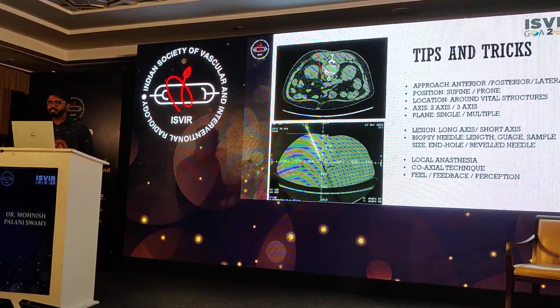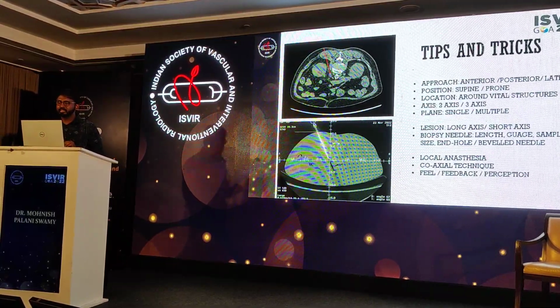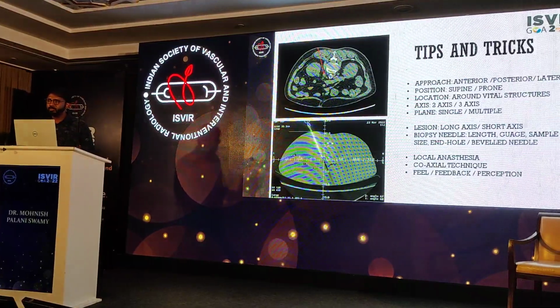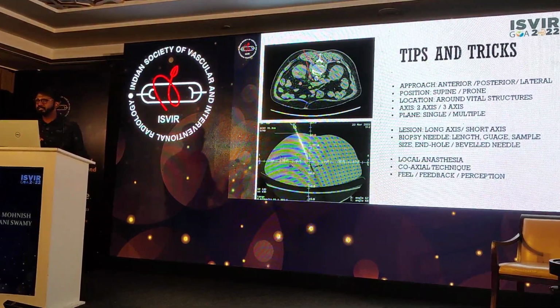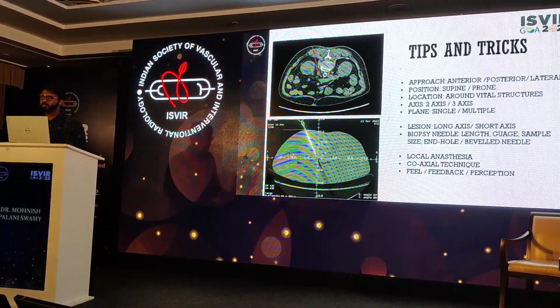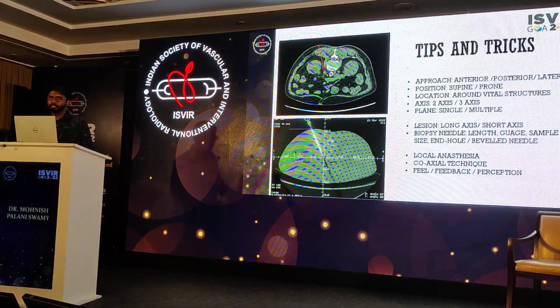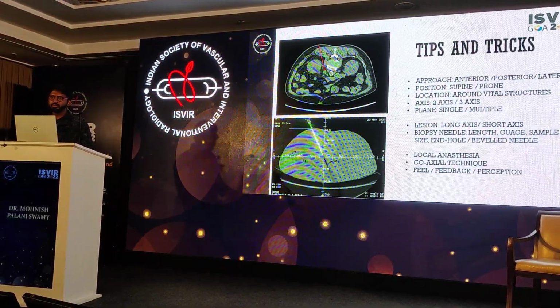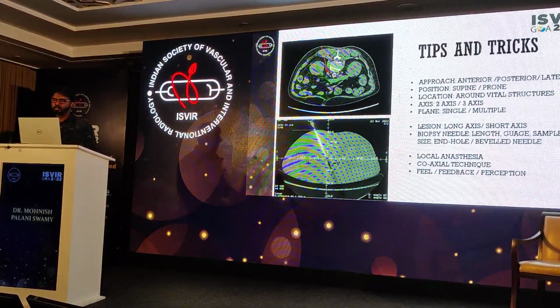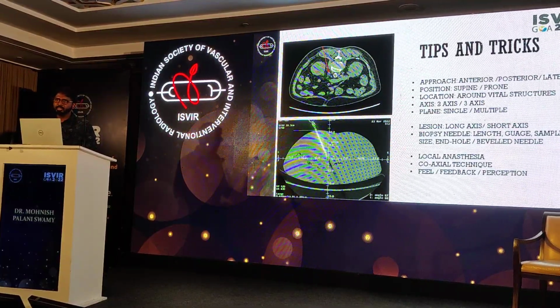And for biopsies, you always have to take into consideration whether you're using an end-hole needle or a side-cutting needle. And first of all, I always tell my fellows that if you can get the local anesthesia up to the lesion, your procedure is over 50% done, because pain is the most important component while doing a procedure. When you're able to get the local anesthesia up to the capsule of the lesion, most of the procedures go comfortably, and you can finish the procedure in 15 minutes.